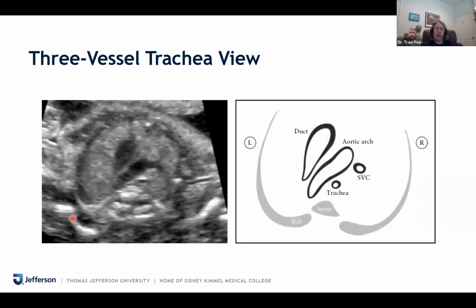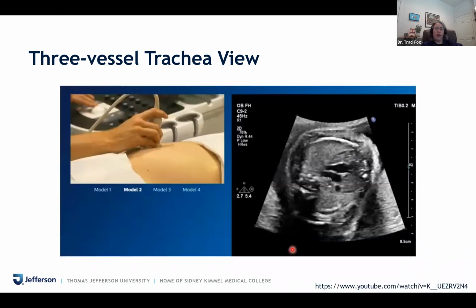Here, oh, I thought that was a video. This is the ISUOG example. And then here's the video on how to get it.